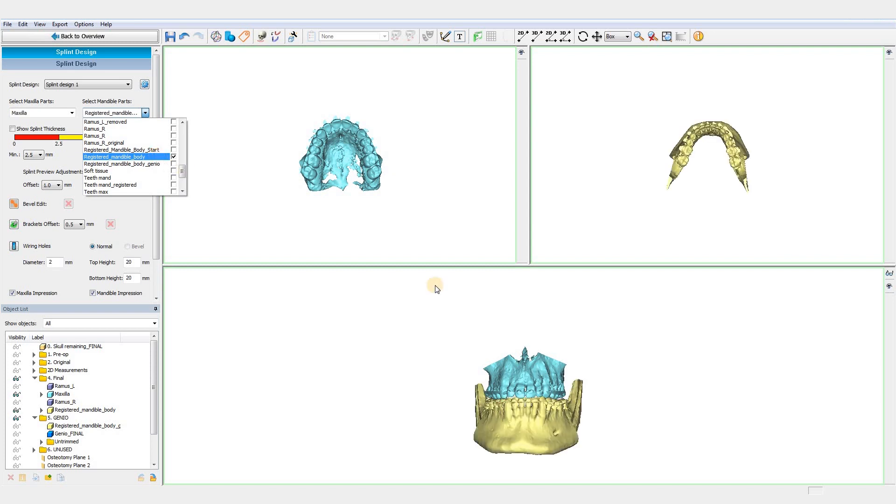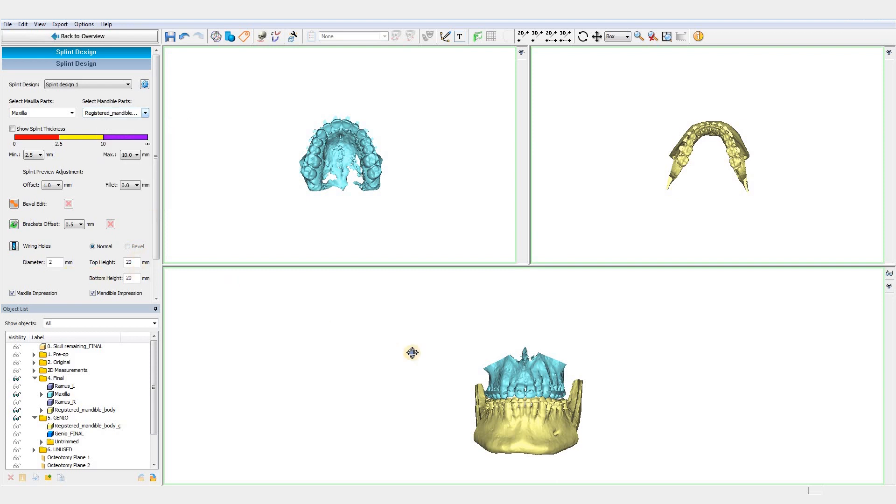In this video, we will only design a final splint, but the same process can be applied for an intermediate one.